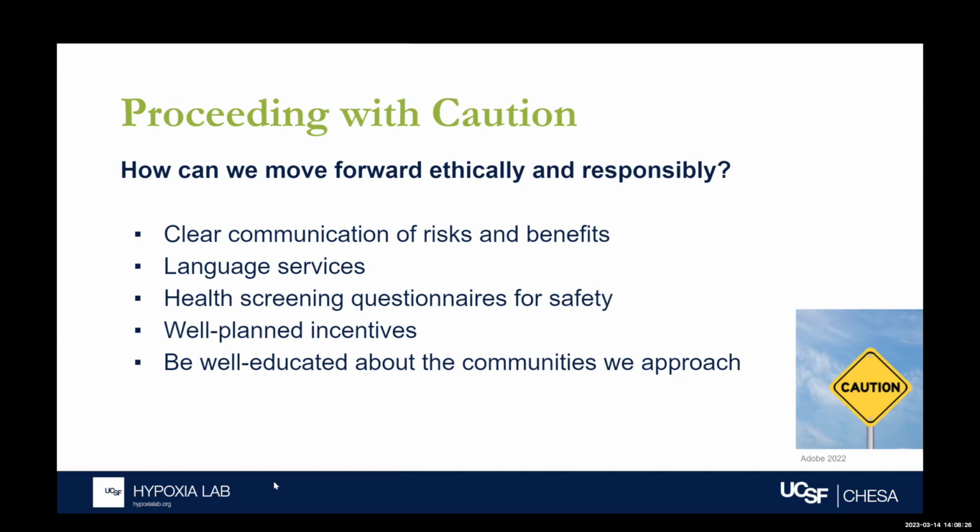So one of the things that we talked about is that we are trying to recruit healthy volunteers. We need to balance the recruitment of healthy volunteers with which incentives we're going to be providing for them. So we don't want the incentive to be such that someone who is not a healthy volunteer is trying to join the study. So that's one of the things that we have to balance.